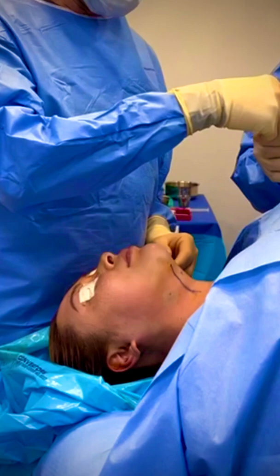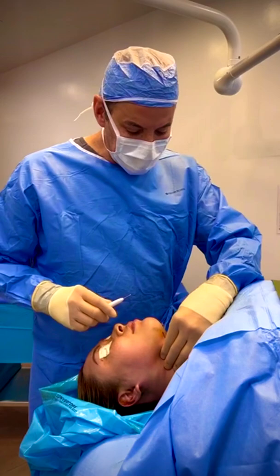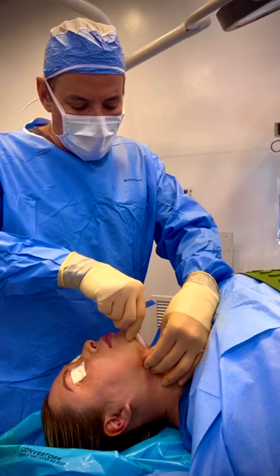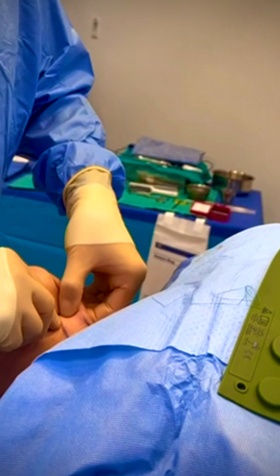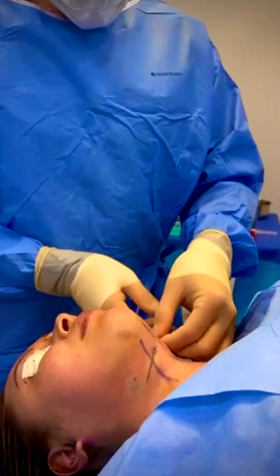We first use the little puncture device to make little punctures in the skin. Now we use the dermal clearing device to just go in the skin — this is used just to make sure that each little opening is completed. Then I'm going to lift up the skin here and go through the little edge of the muscle. We use the dermal clearing device to make a little tunnel. We've done that on her right side, now I'm going to do it on her left side. Now we're going to divide the band — we take the rod, go in the center, and go through the band. We've already made a little passageway just like that.